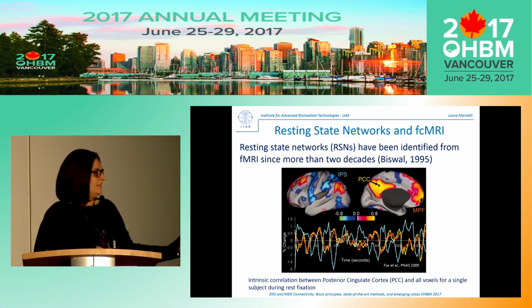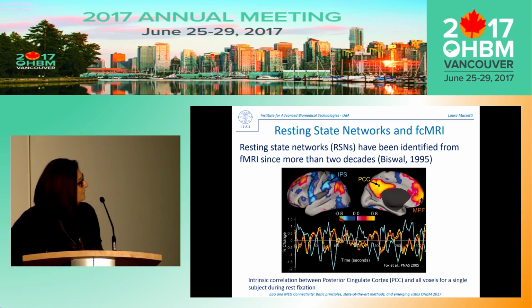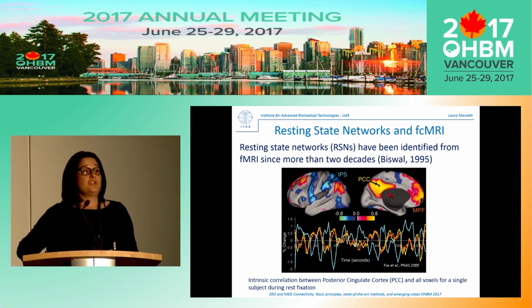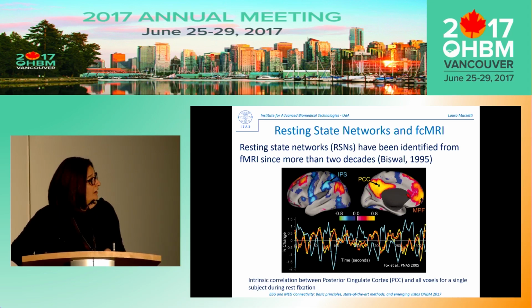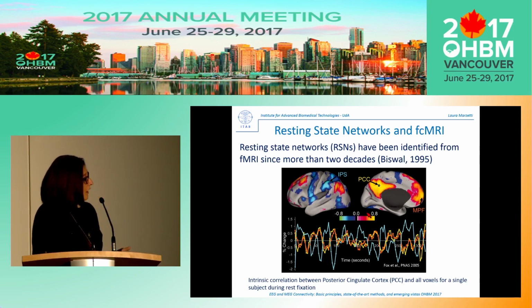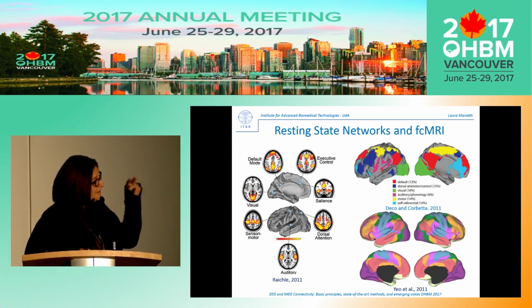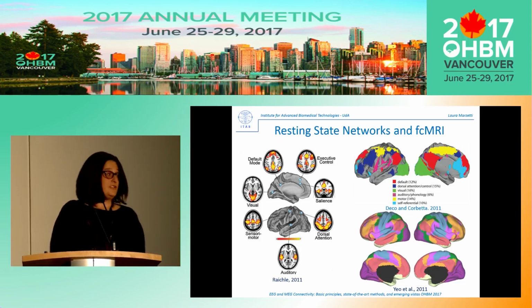Later on, these spatial temporal structures have been deeply studied. With the idea that if you choose a seed, one region in the brain, then you can highlight structures which are correlated at rest, when the brain is resting. The red structures share the same spatiotemporal pattern as our seed, while there are other regions which behave out of phase with respect to that. This initial notion has been largely extended, and in recent years full coverage of the cortex has been obtained, which parcels the cortex into different networks with different functions.